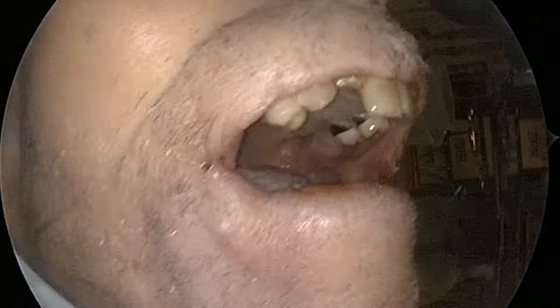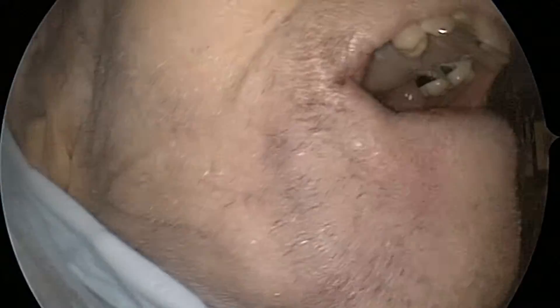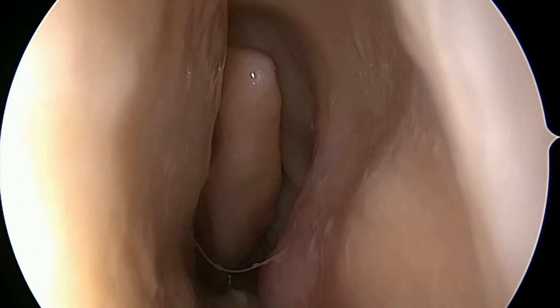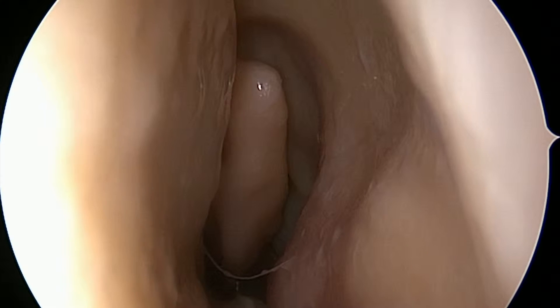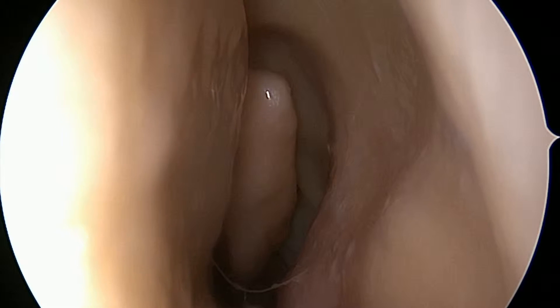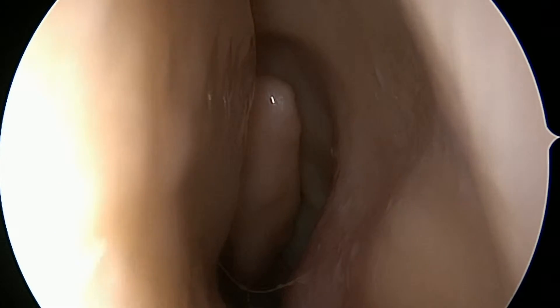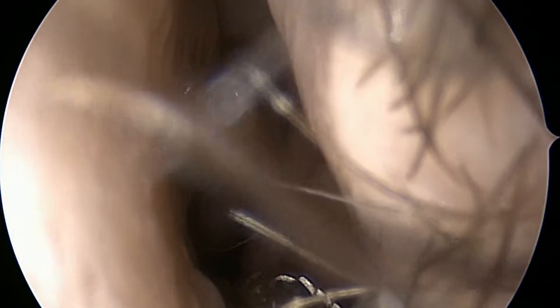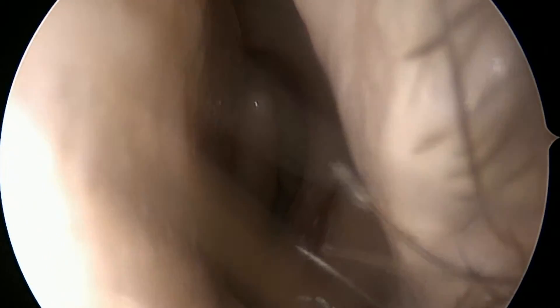So we're going to start by looking at the CT scan. We want to start out with a good systematic review of the CT scans. One of the things that's really nice about image guidance is that it has put us in a paradigm in which we're always looking at triplanar film, which gives us a huge amount of information.